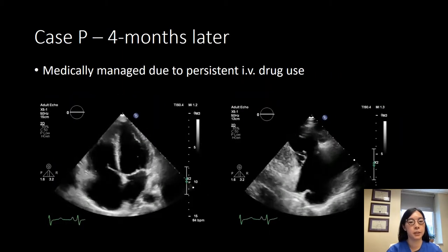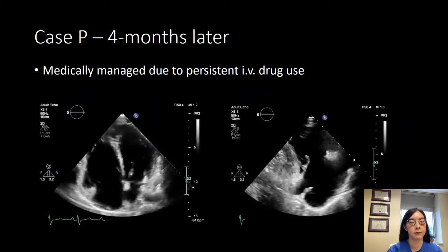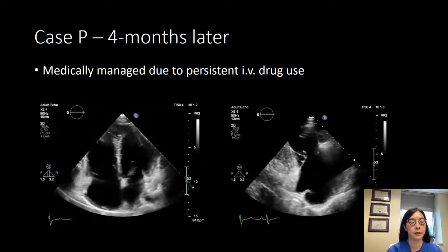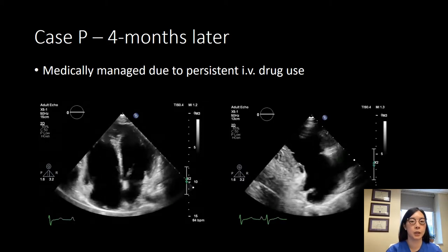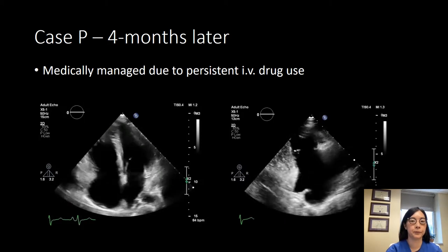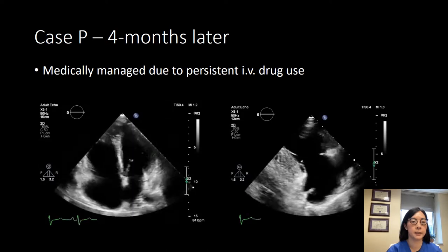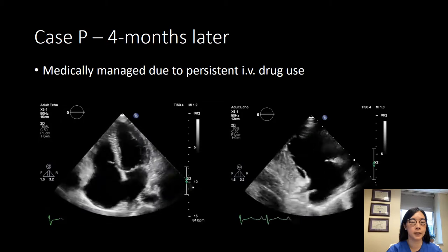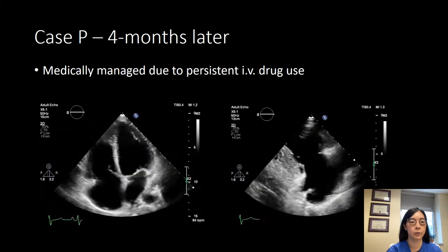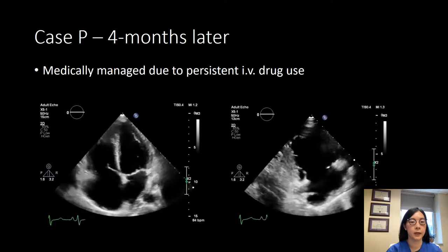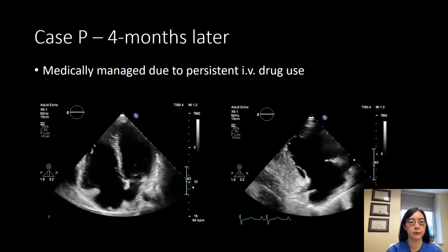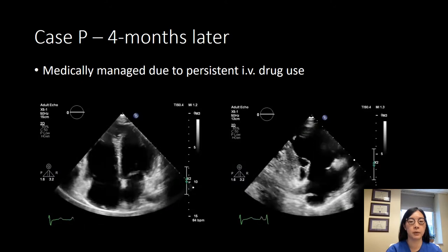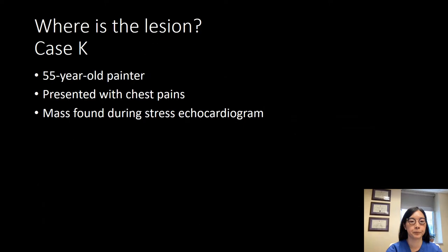For follow-up: this patient was medically managed because of recurrent IV drug use. This shows the natural history of medically managed infected endocarditis — the entire anterior leaflet has now been destroyed. The RV, due to volume load, is dilated and enlarged, and on the inflow view you can see that remodeling has caused the cords from the septal leaflet to now tether the leaflet as well.